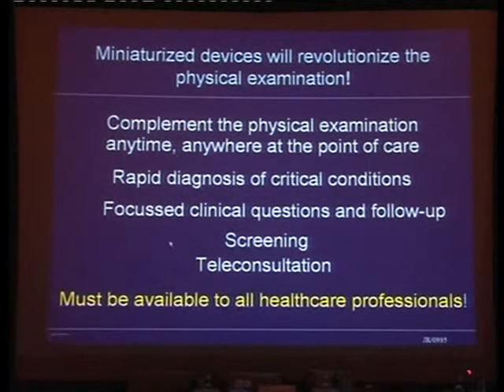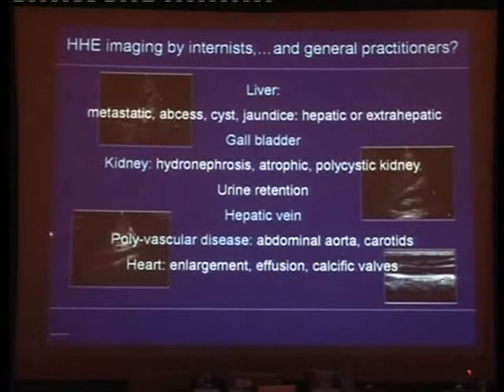So the miniaturized device will revolutionize the physical examination because they will complement it anytime, anywhere at the point of care. There is a rapid diagnosis of critical conditions, or at least an orientation to refer the patient. Then there are focused clinical questions and follow-up that we can apply. We can use it for screening, but that's already more expert work, and a teleconsultation. And it's my opinion that echocardiography should become available to all general practitioners and all healthcare professionals.